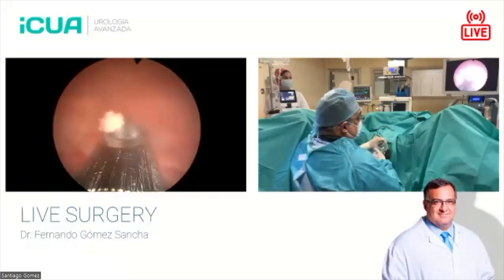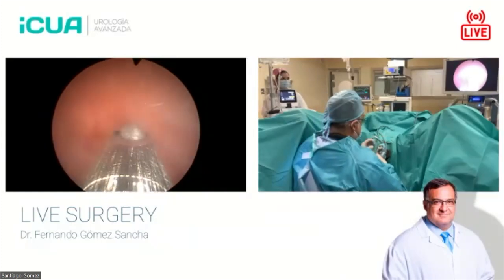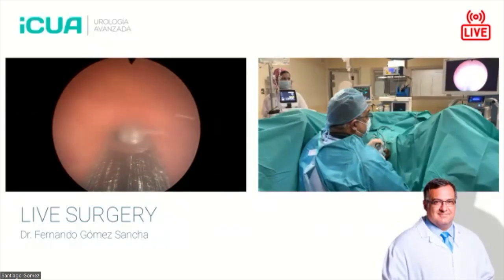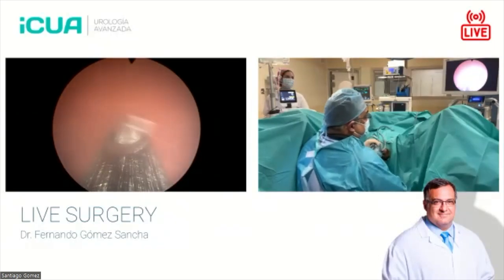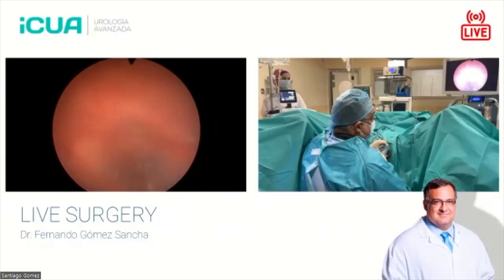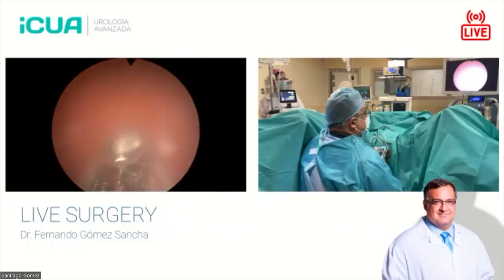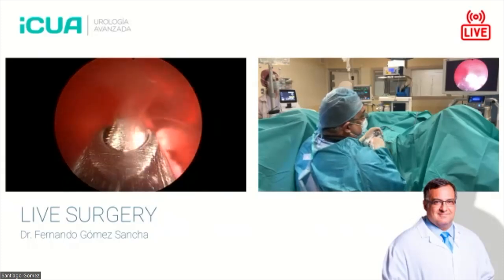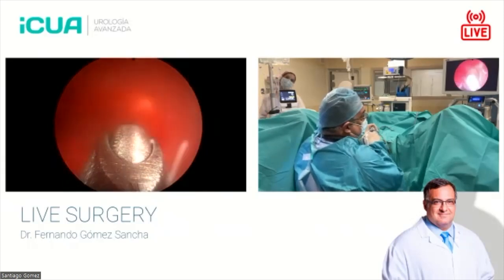So, for example, if you do a HoLEP with a minimal caliber instrument, like Felipe is proposing, but it takes you 3 hours, is this more aggressive than doing a HoLEP in half an hour with a bigger caliber scope? We don't know.